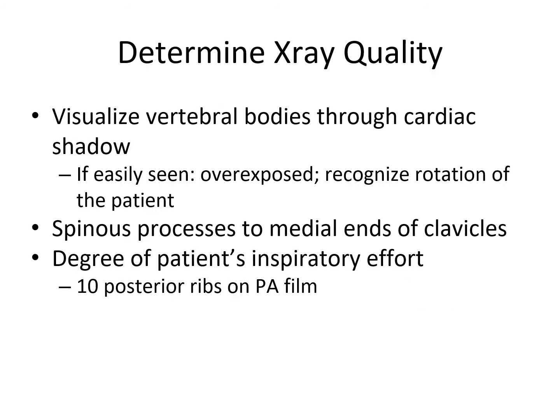This is just talking about looking to see if it's overexposed or not. It's some of the stuff that I already talked about. Inspiratory, you want it to be 10 posterior ribs on the PA film.